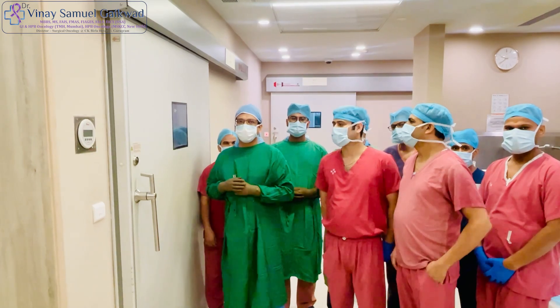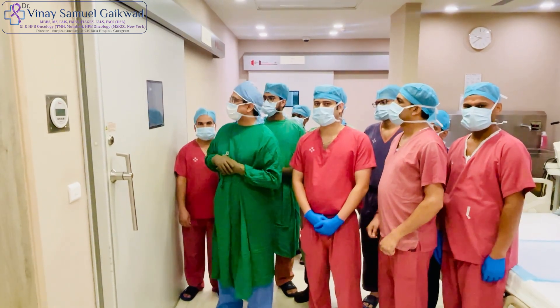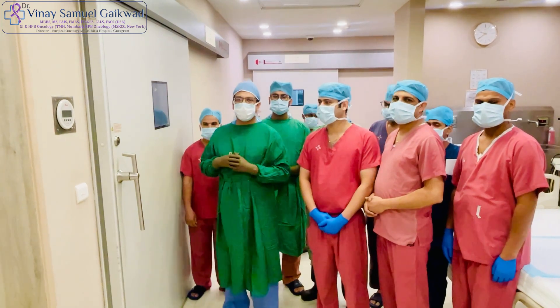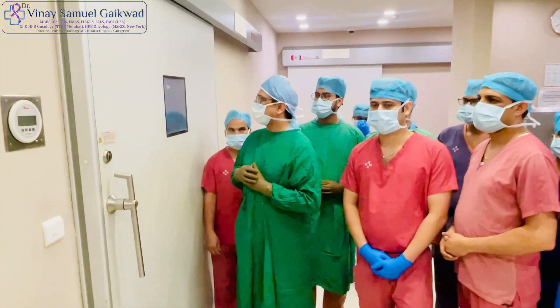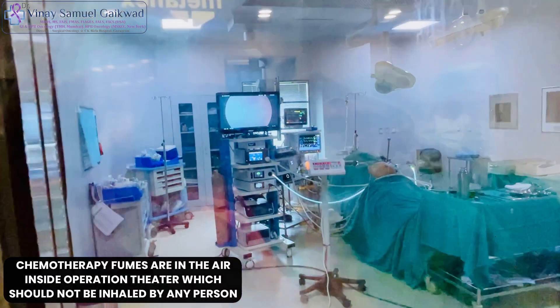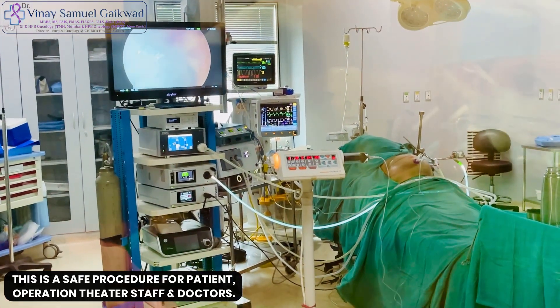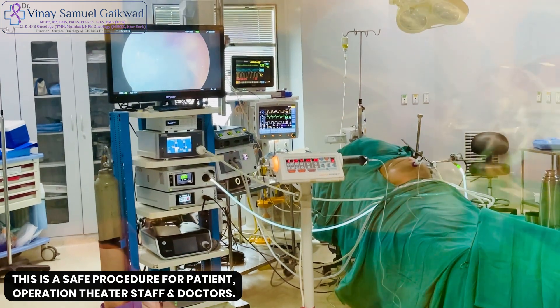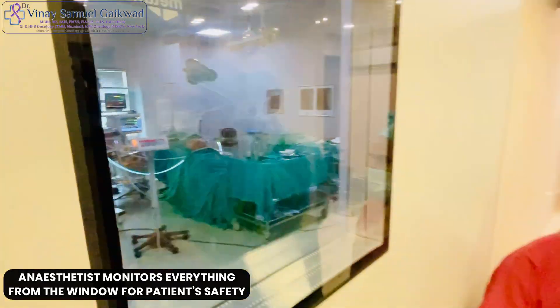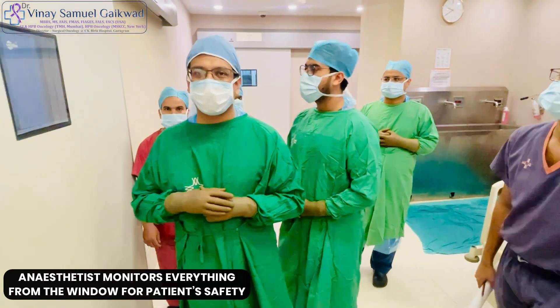The PIPAC procedure is now in session. You can see that we are all standing outside the operation theatre. The chemotherapy is being infused into the patient through an aerosolized form, and you can see what's happening inside through the window, because the fumes of chemotherapy are in the air and we don't want to be inhaling that as healthcare providers. This is a safe procedure for both the patient and the operation theatre staff and doctors. Even the anaesthetists are outside with us, monitoring everything through the window so that the patient is safe throughout this procedure.